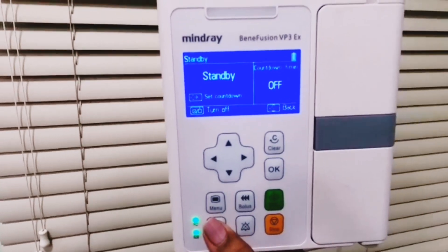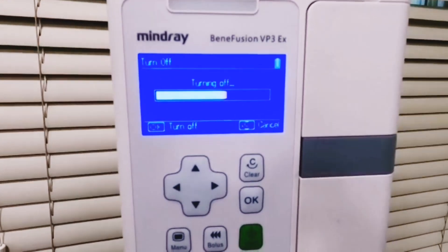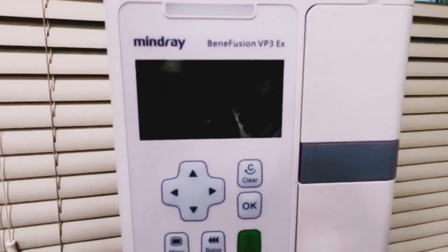To safely turn off the apparatus, press and hold the off button. The device will power down.